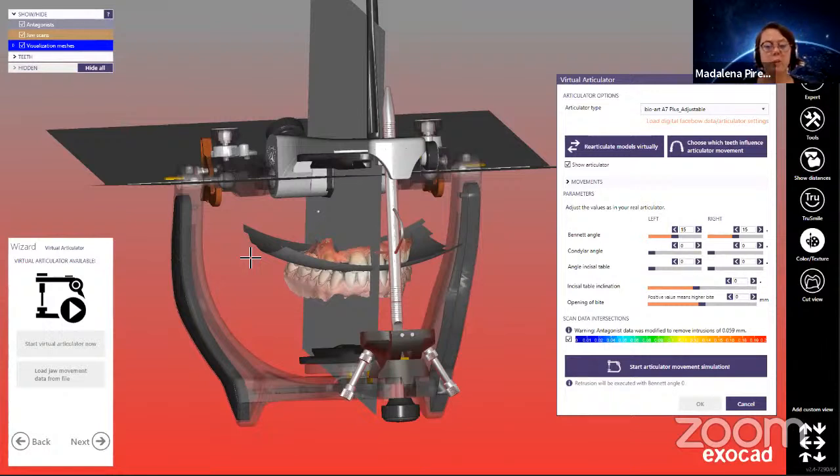So we register what we can, maybe a few chewing cycles, which is usually, you know, a survival thing. Everybody, even if you have jaw dysfunction, found some sort of way of chewing food. And we're going to record what we can. We're going to do the setup in the virtual articulator for either a correction device or to re-educate the patient or relieve the pain.